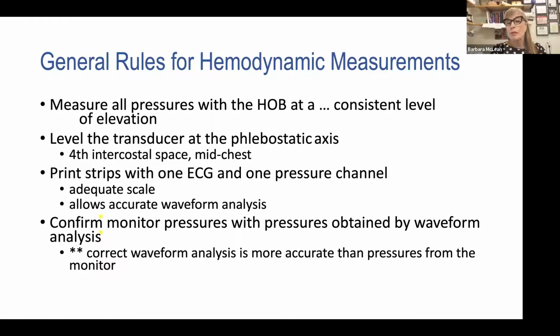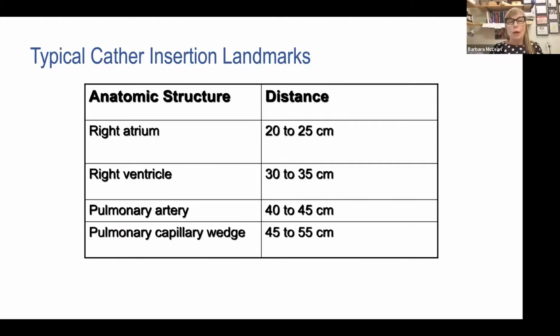And the reason you need to do that is because the monitor is going to average the patient's pressures together when it displays the patient's pressure. But you really have to be able to look at waveforms and waveform analysis to have a good understanding of what's happening with your patient who has the PA catheter. Now, I will also say the same thing if you've got CVP. It's really important to do a dual channel recording and for you to evaluate your patient's pressures.